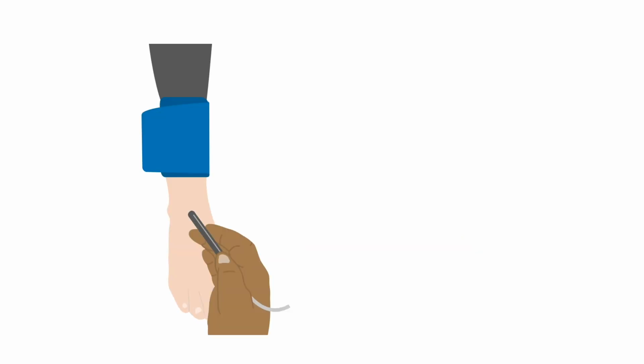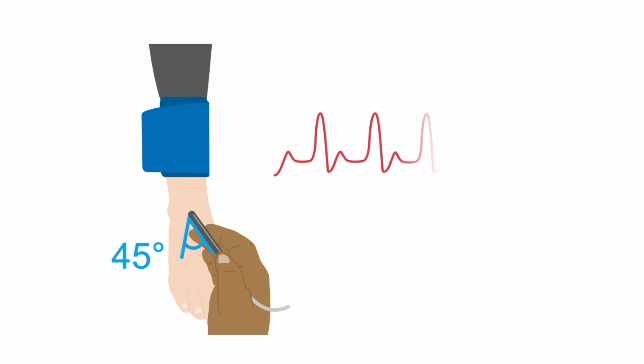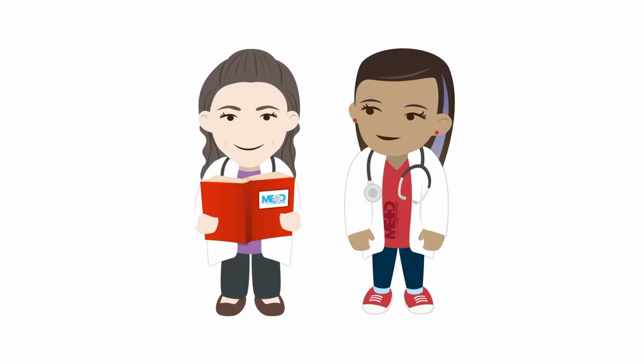Next, apply the cuff to the right ankle just above the bone. Find the dorsalis pedis artery, DPA, by sliding the Doppler from inner to outer ankle across the anterior ankle. It will cross the DPA. Adjust the Doppler pen angle to 45 degrees to the skin and listen for how many peaks and pits you hear. This is your first clue as to presence of disease.